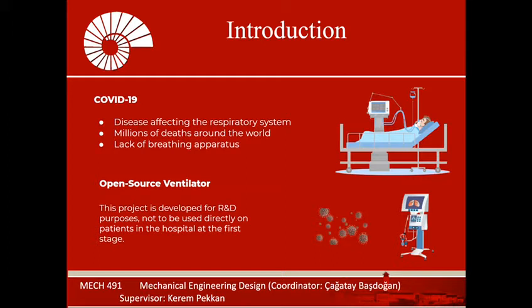A ventilator is a way of measuring and controlling the volume pumped and the breath rate, monitoring inspiratory pressure and the inspiratory to expiratory time ratio. This project is developed for R&D purposes, not to be used directly on patients in the hospital at the first stage.